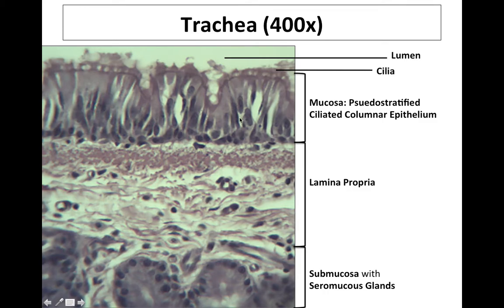These are columnar cells that you see, but the unique visual representation of these columnar cells is such that the nuclei don't sit in line with one another, as we saw with other types of simple columnar epithelium. And so it gives this appearance that you're looking at a stratified tissue type with multiple layers. Again, since this is not really the case, it's pseudostratified. So please make sure you know the name of that tissue, plus the fact that it is in the mucosa.